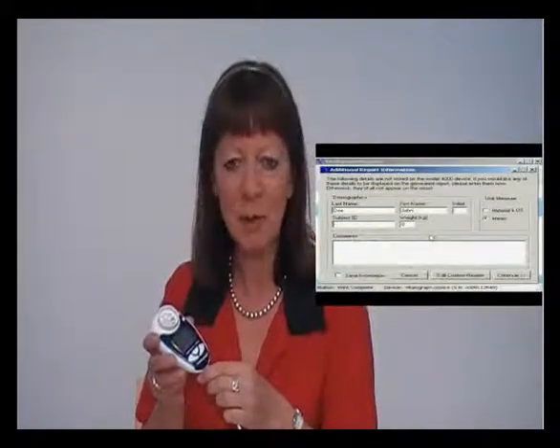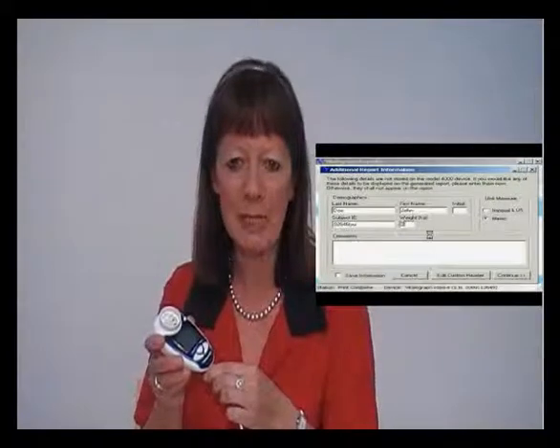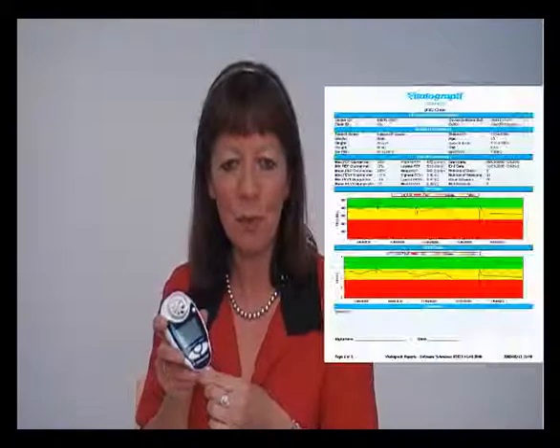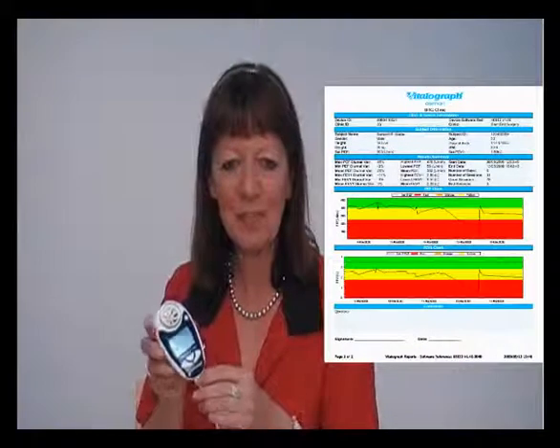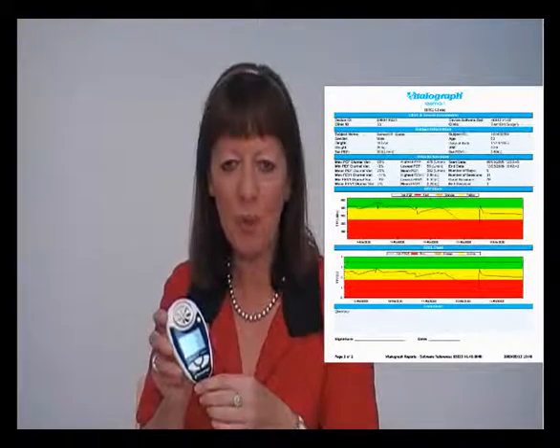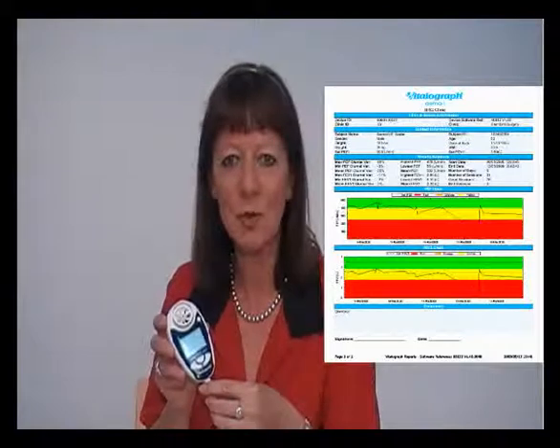You will be given the facility to fill in subject demographics and comments on the PC screen. A colourful PDF report document will be generated. This document can then be stored with a subject record or emailed to other healthcare professionals for comment or discussion.